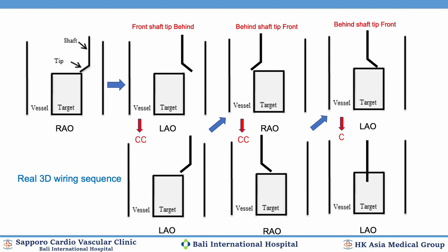With this method, I will show you some cases. Target here, then shaft right-sided. Then move to the same side, shaft is the same side, RL to LL. So the shaft is front. Then move counterclockwise, like that.